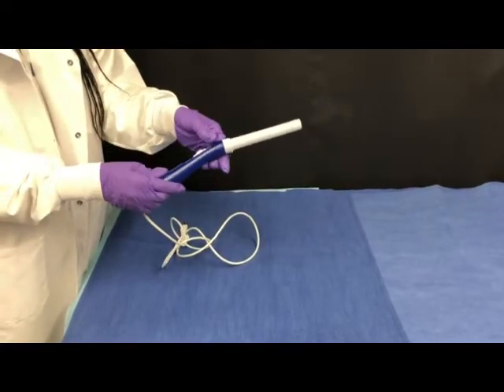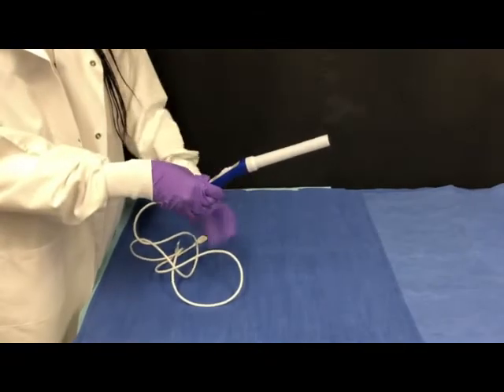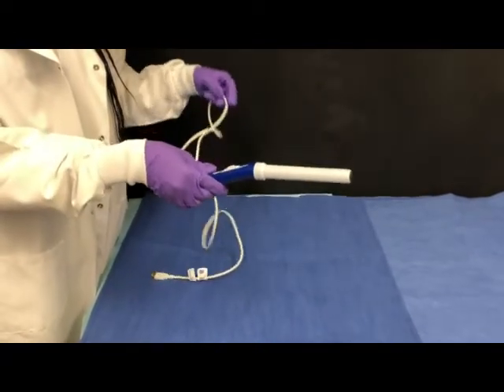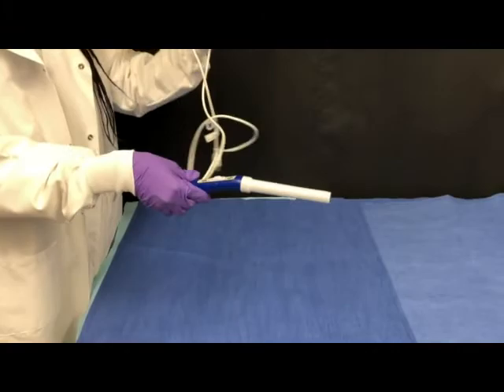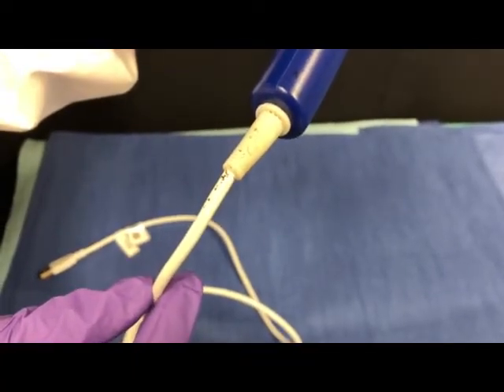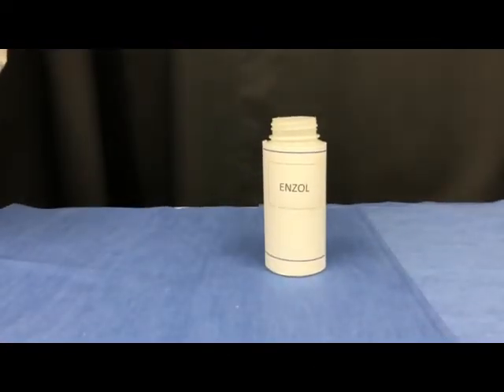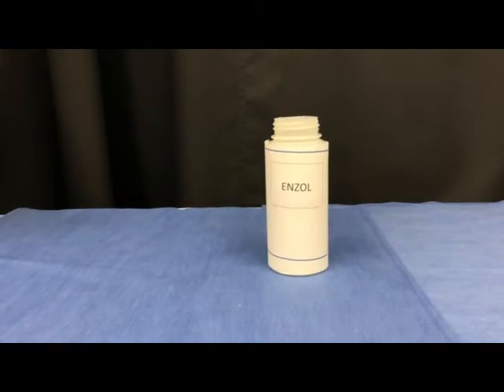Inspect the cord and handle for visible soil. If there is no soil present on the handle or cord, you can move on to the next step in the process and begin preparing Sidex OPA. However, if visible soil is present, you will prepare an enzymatic detergent. If there's visible soil, prepare an enzymatic detergent like Enzol according to the manufacturer's instructions.